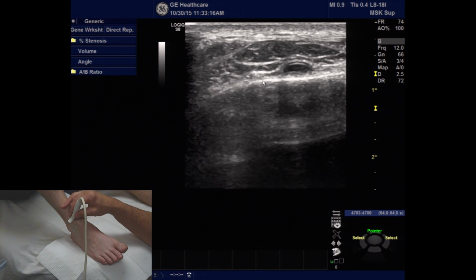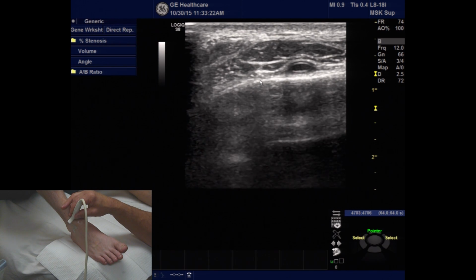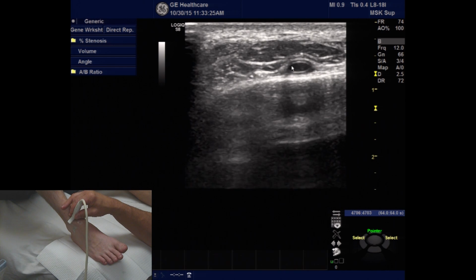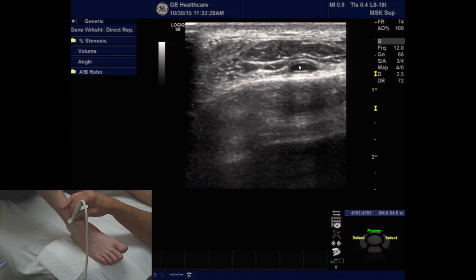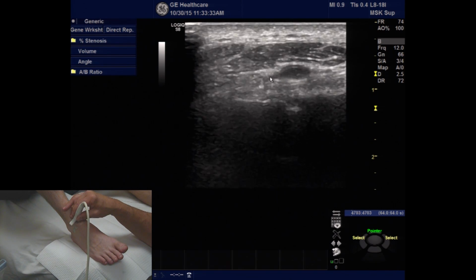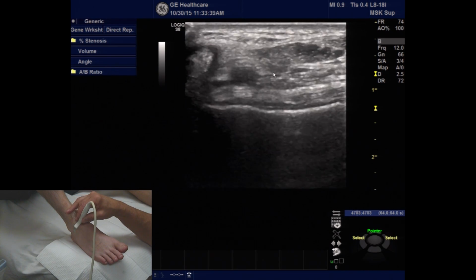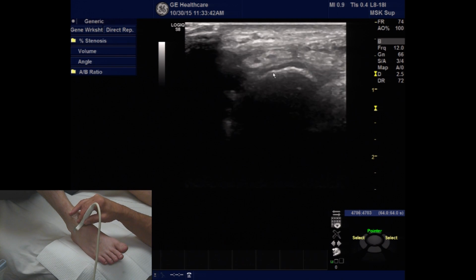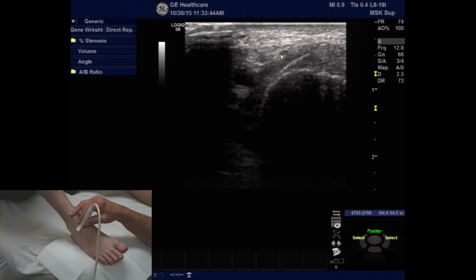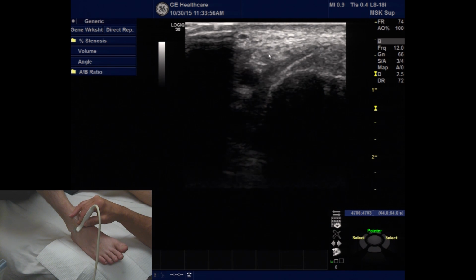One other aspect, and this is for the more advanced evaluation, is when you look at the deep peroneal nerve in its short axis sitting onto the tibia, with the dorsalis pedis artery pulsing just to the right of that. As I move the transducer towards the toes, the deep peroneal nerve will cross over the top, and as I continue my downward motion, we can see that the deep peroneal nerve is going to divide into a medial and a lateral aspect, with the medial section supplying the first web space and the lateral aspect supplying the dorsum of the foot.